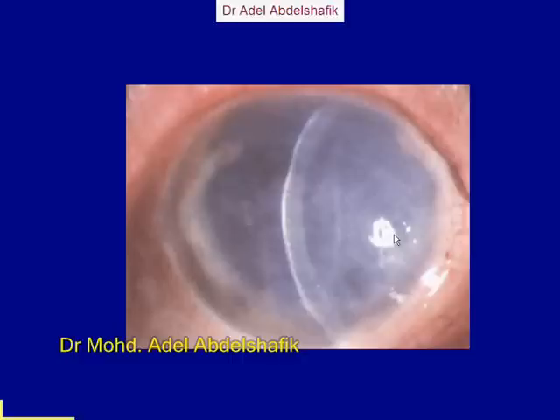Again, what do you see here? It's a hazy cornea, and there's marked thickness of the cornea, and you can see here the double line. One of the things I want to draw your attention to here is this back surface, where we see folds in the Descemet's membrane. You see it very commonly if a patient underwent cataract surgery and the manipulation during the surgery was rough. Then you see these folds in the Descemet's membrane. They are there for some time, then they disappear. Why is that?